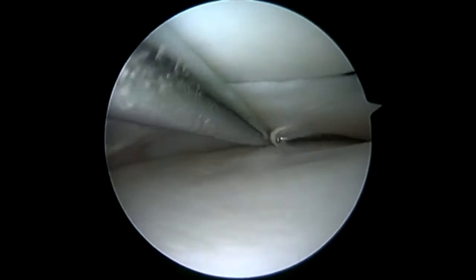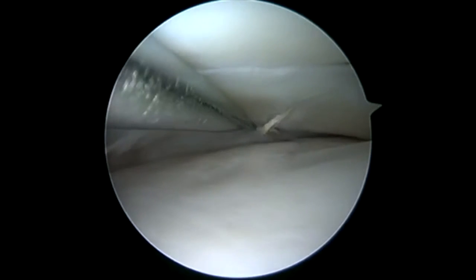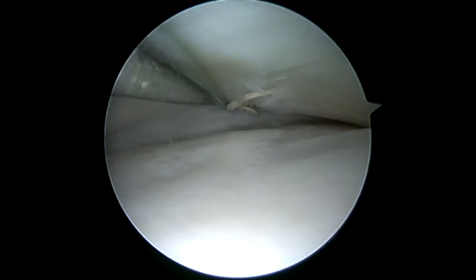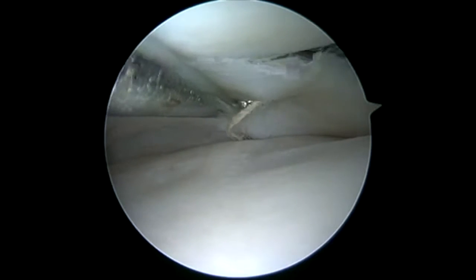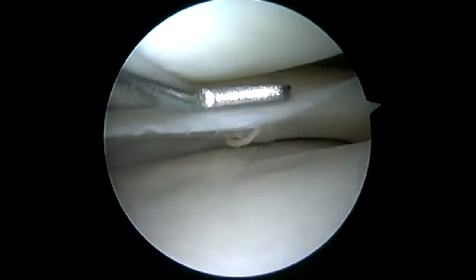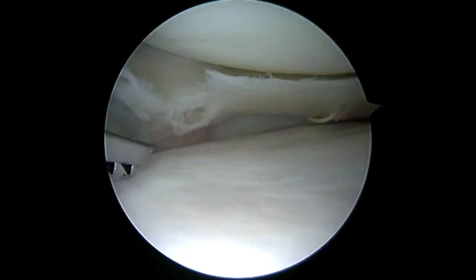We're going to look more towards the posterior horn. We can see a second meniscal fixator. This one also appears to have at least one within the meniscus, and there appears to be one outside the capsule. Watch this meniscus snap as I move across its contour, telling me that implant is right there in the meniscus itself. You can see it snap as we move across the implant, telling us that position is intra-meniscal on that secondary fixator.